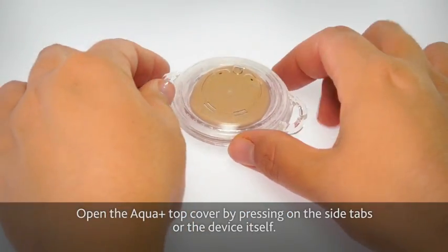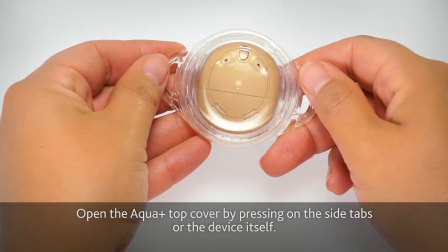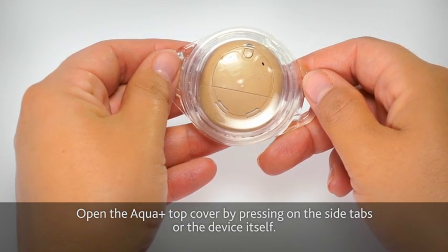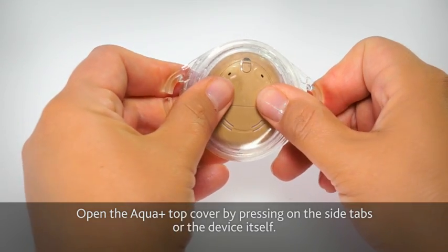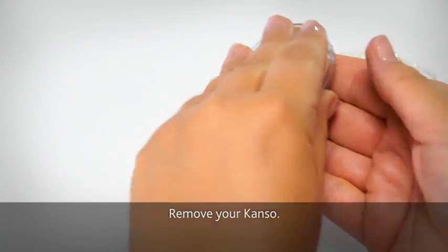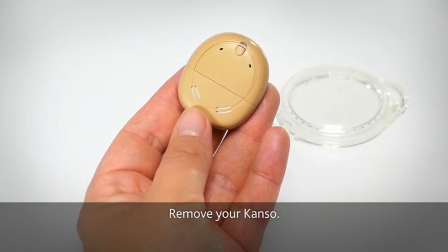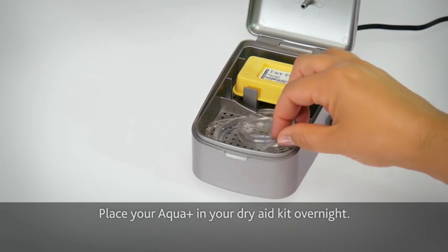Open the Aquaplus top cover by pressing on the side tabs or the device itself. Remove your Kanso. Place your Aquaplus in your DryAid kit overnight.